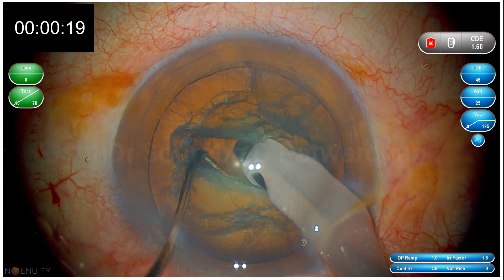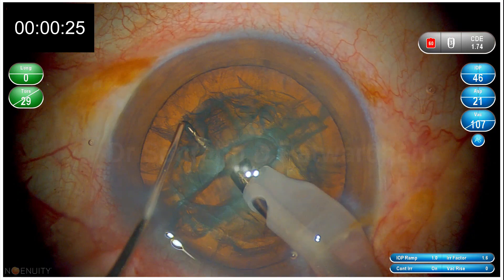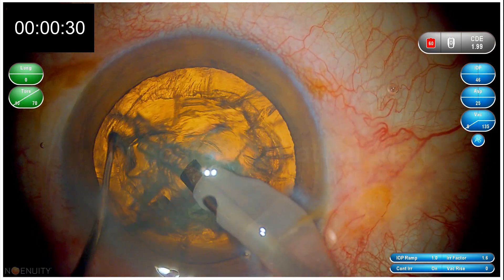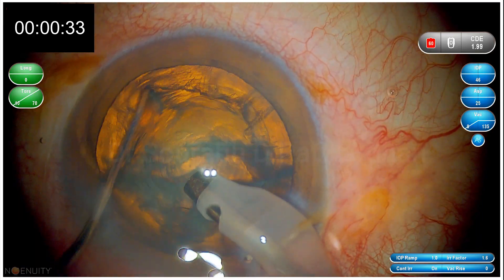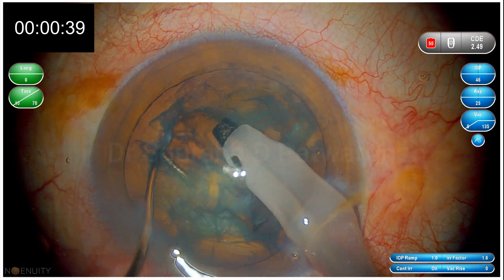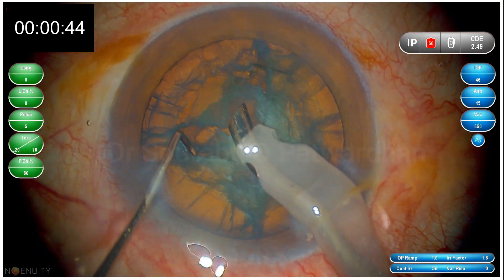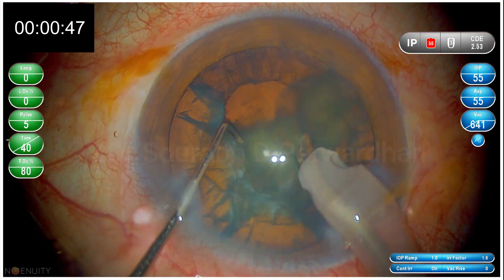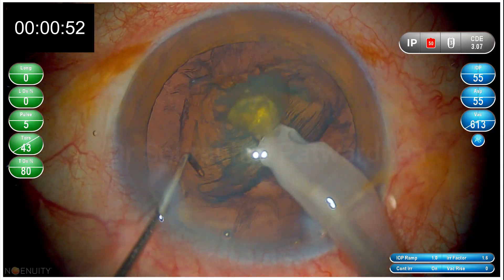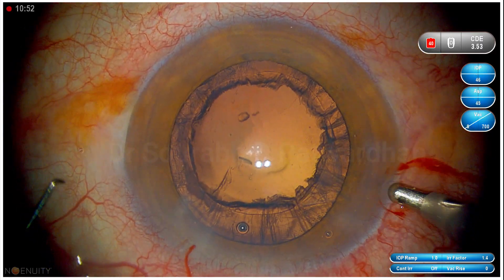As you can see, the right depth is being achieved. My chopper in the horizontal position at the depth of the groove is very helpful. This 1.5 mm Boertnain chopper is really useful to master trench and divide. The second trenches usually require 3 or 4 passes of the phaco tip. You then have complete separation of the pieces, and all pieces are separate — you just have to go to quadrant removal.